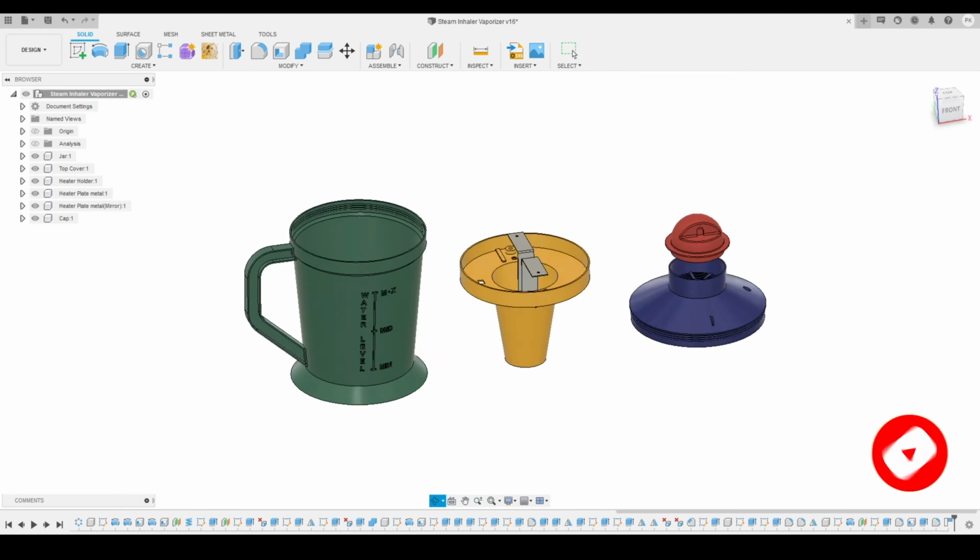So I will create a horizontal line like this, then I will come to the bottom like this at a particular angle. Here you can see, and I will connect from here to here. So this is the shape we got, and now what I will do is I will start defining the dimensions to make the handle look more correct and in the right scale. So here you can see we had defined a few more dimensions. So I had just skipped the part of the video to make this video a little shorter.